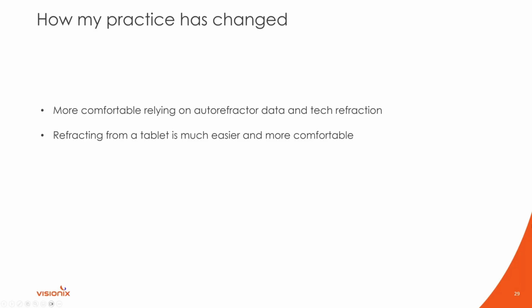Being able to refract from a tablet is very convenient, especially with patients that may have health issues. Being able to distance yourself allows them and yourself to conduct a safe and healthy refraction. Especially right now, going from summer to the school year, we're getting a lot of pediatrics, a lot of children getting sick, which then adults are getting sick. Being able to refract and have that distance is invaluable, making sure that you yourself stay healthy, as well as making sure that no disease is being spread, such as the flu and the common cold.